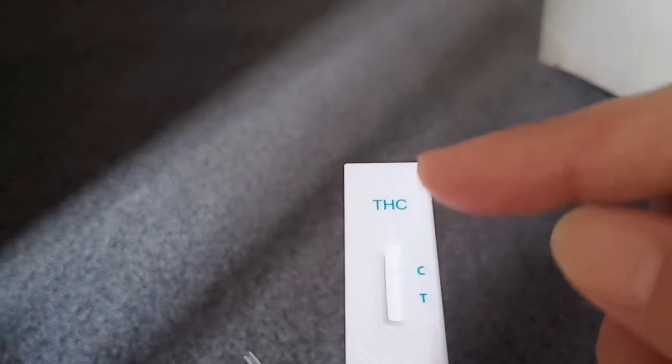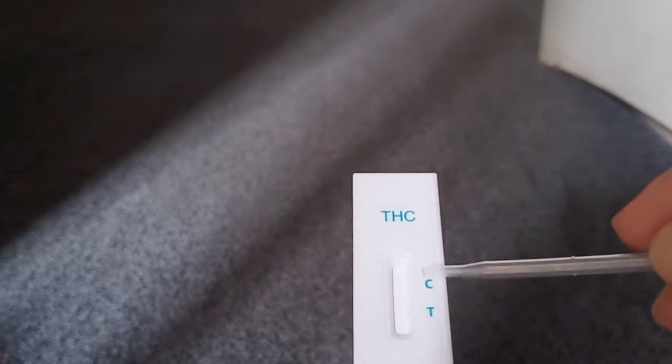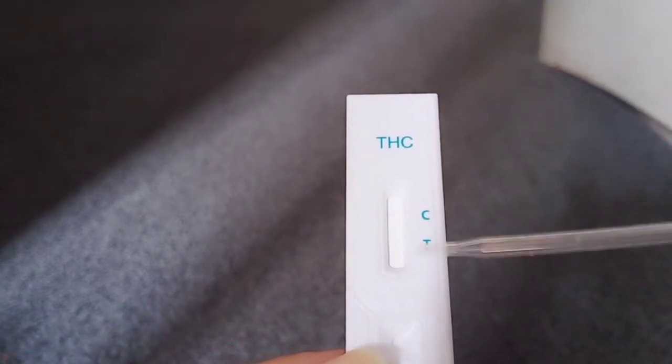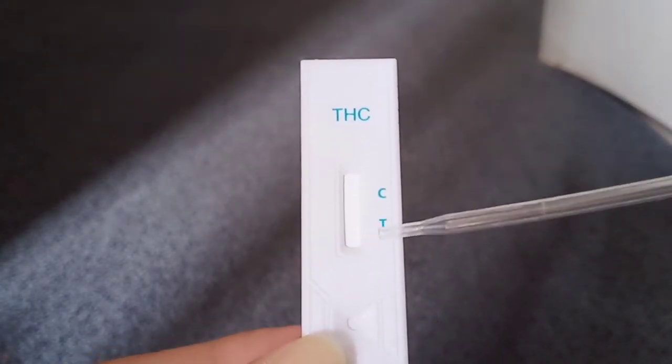Once it soaks up, you'll see either one line at the top, which means it's positive for THC, or two lines — one at the top and one at the bottom — which means it's negative. If it's blank, that means it's invalid, and you'll need to get a new product to try out.